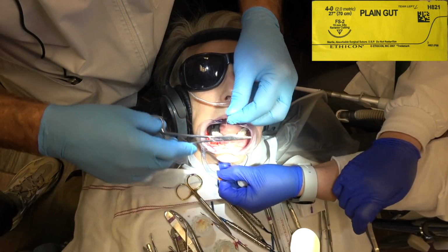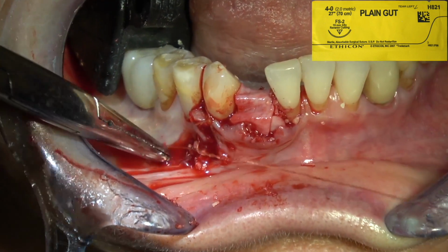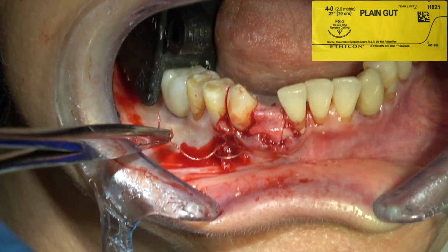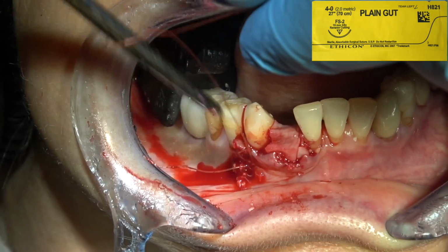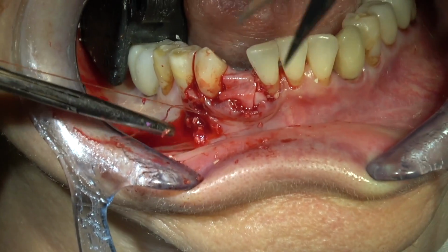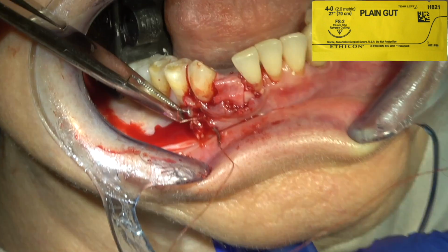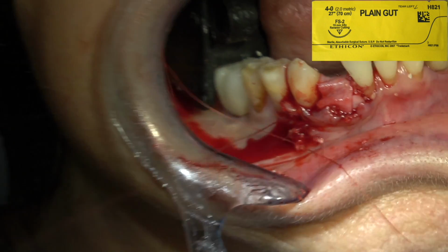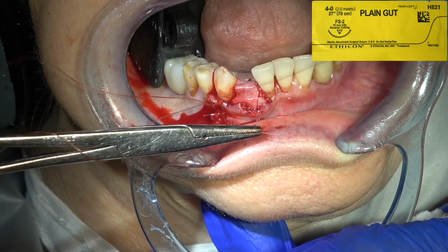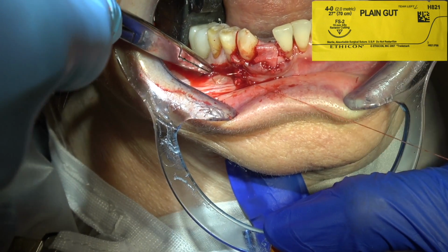So I don't want to reflect a lot of tissue just to get primary closure, because in my experience of doing this 40 years, that's not of consequence. If part of the flap does not have primary closure, as long as you've got resorbable collagen membrane or platelet-rich fibrin under the tissue covering the graft, it's going to heal just fine. I know some people say you need primary closure in these cases, and you have to reflect all the way to the chin to get the tissue to cover the graft site. I've never believed in that because I want the blood supply.